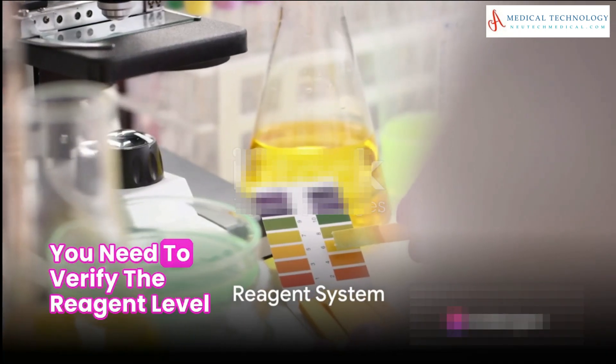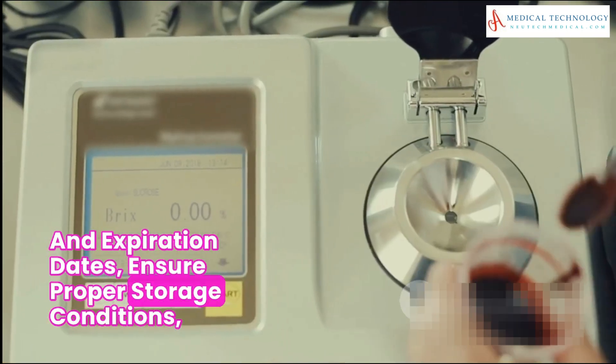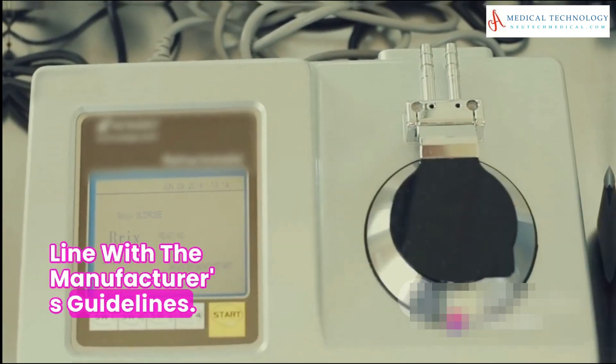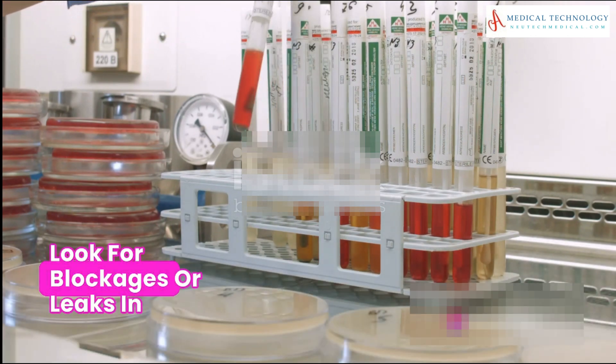Then there's the reagent system. You need to verify the reagent levels and expiration dates, ensure proper storage conditions, and replace reagents if necessary — all in line with the manufacturer's guidelines.